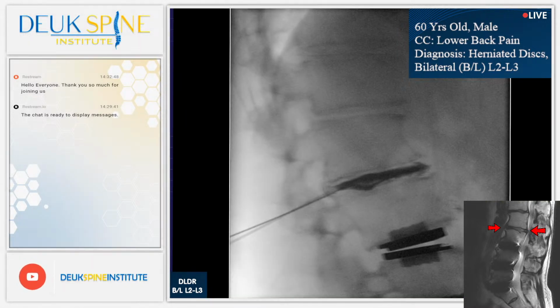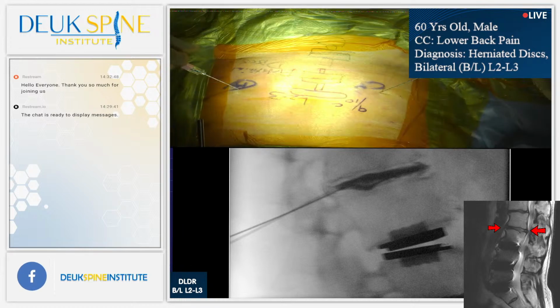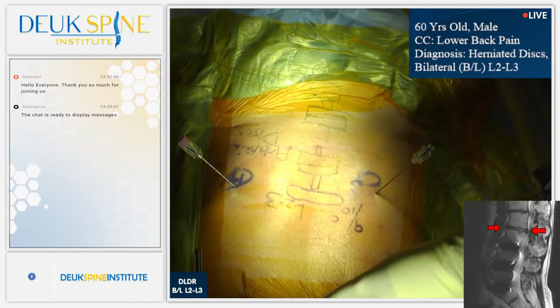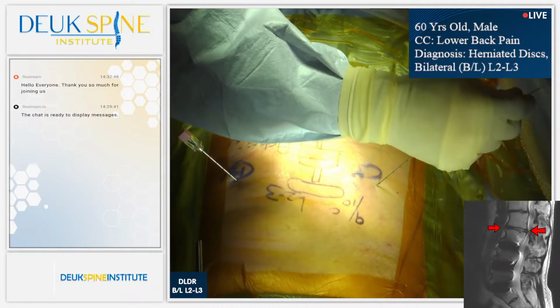Nine? Is that where you get your pain? All right, sir, you just had a discogram. Now you know what a discogram is all about, and it confirmed your pain source. I want you to count from 1 to 100 out loud. When you wake up, your surgery will be over. Pleasant dreams.